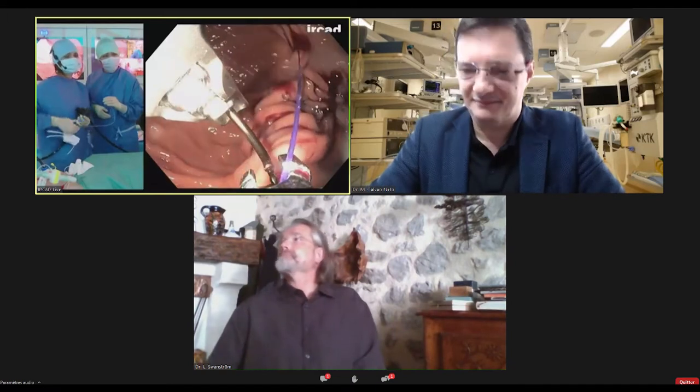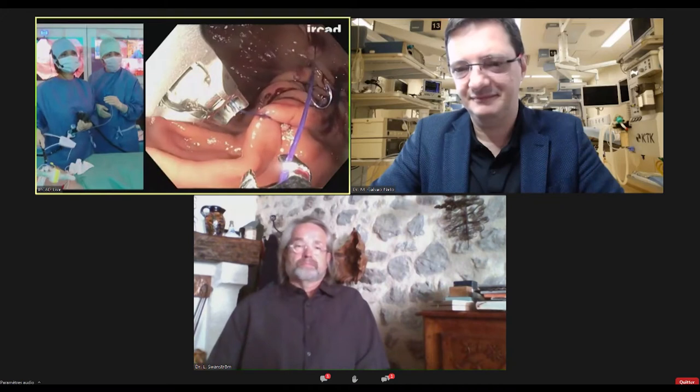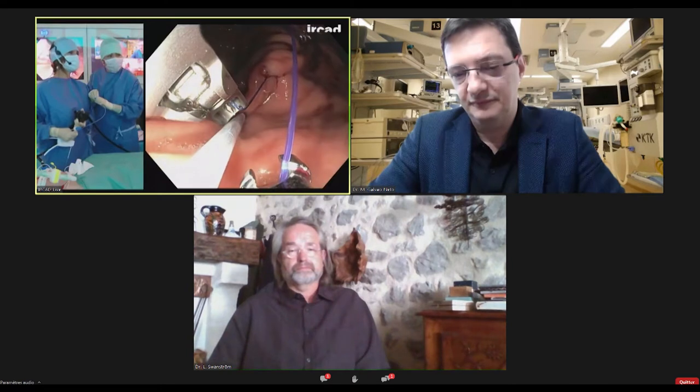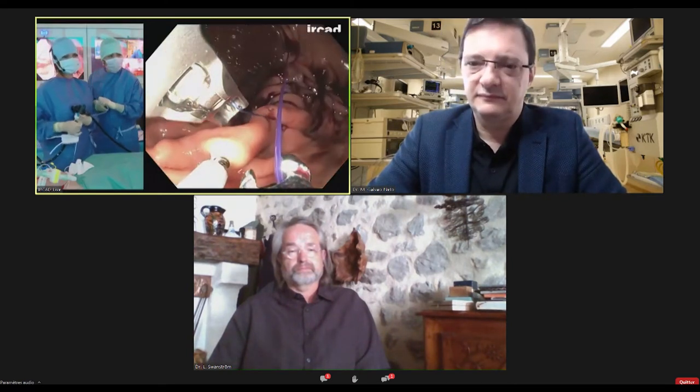It's very rare, actually. I mean, it's not very rare. I never had really important, substantial bleeding. I always had the kind of bleeding that you have seen just before. And this is something that happens all the time. And you just pull a little bit onto your suture, and the bleeding usually stops.